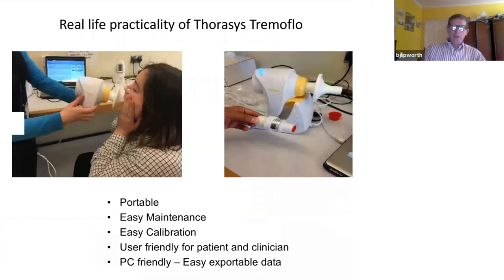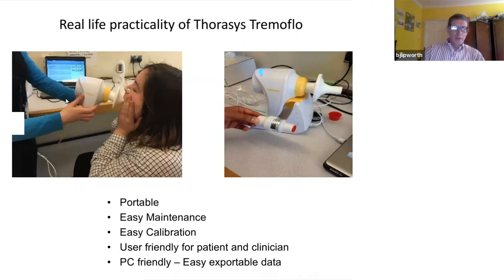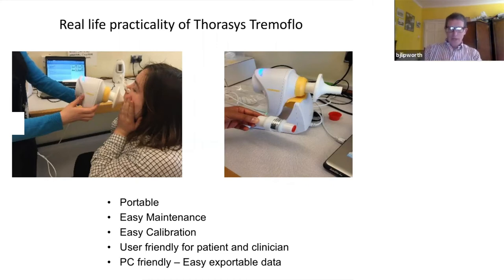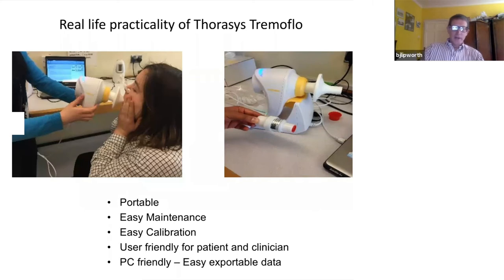When you're using the tremor flow device, you can see it's very portable — you can move it from room to room. It's hooked up to any laptop and is very easy to maintain and calibrate. You don't need a huge three-liter precision syringe. It's very user-friendly for both the patient and the clinician.